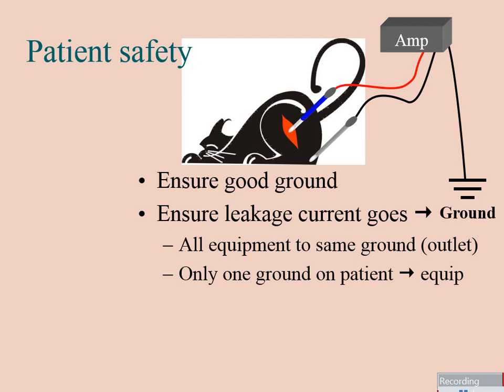So you want all the equipment, if you're using multiple pieces of equipment, and again, with modern stuff, it's all one big package and you don't have to worry about this. But when we used to have separate stimulators and separate preamps and separate recording amps, you had to make sure that there was one common ground for all that equipment. And that the patient is actually grounded to the same ground as the equipment.